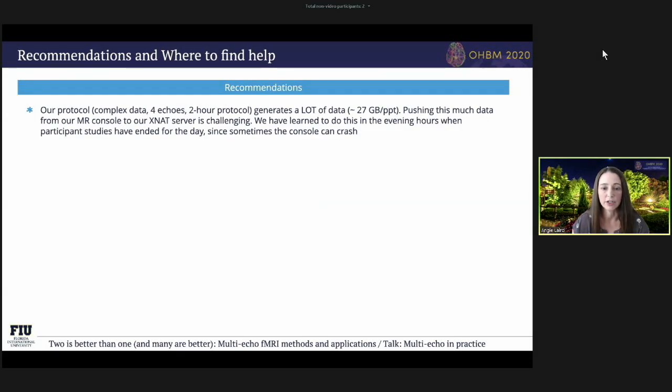So we learned a few additional lessons along the way. Once we started collecting data, we realized how much data we're actually generating. After all, we're acquiring 4 echoes, complex data, and have a 2-hour protocol. So our typical data set is 27 gigabytes per participant.